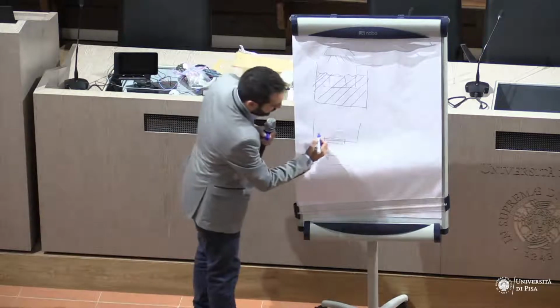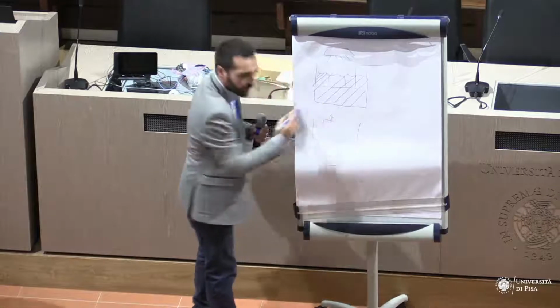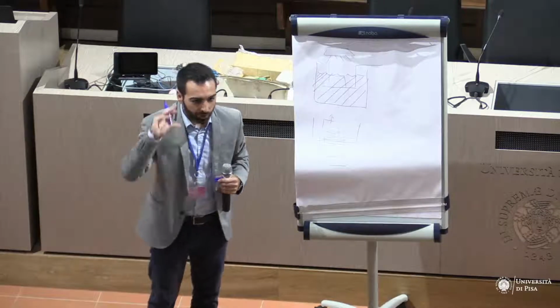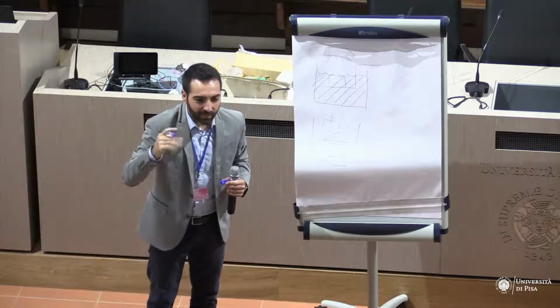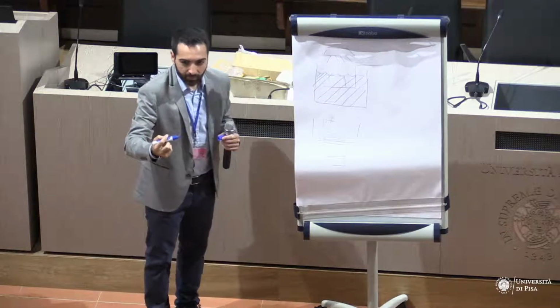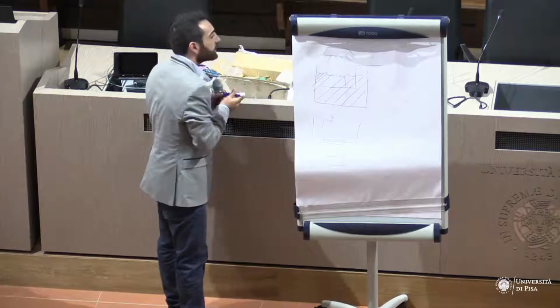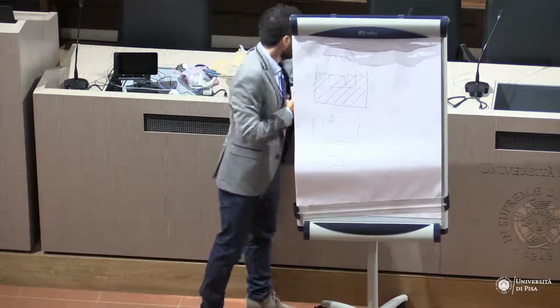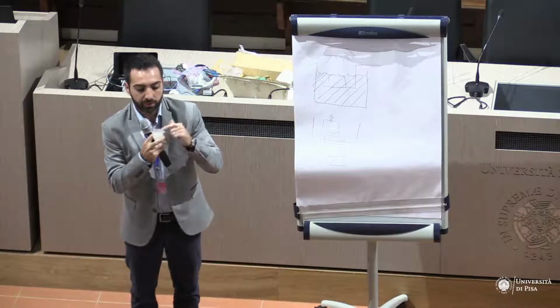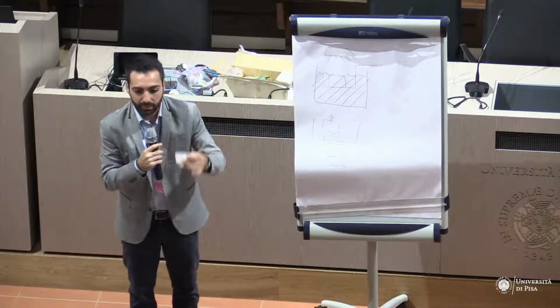So probably I need a few material and move my object toward up in the meantime that it is printing. So just switching the basic idea that you have to put the light from the top, you invented the new 3D printer. With this configuration, we printed the object that I had in my hands. It was printed in this position. So first this one, and then the scaffold, and then this was the last part.